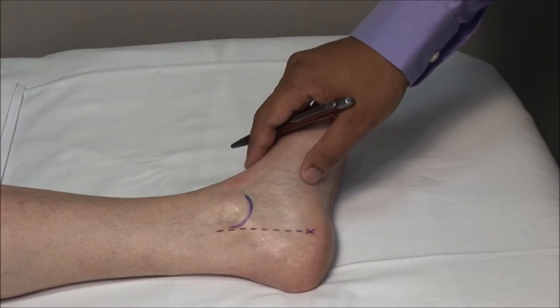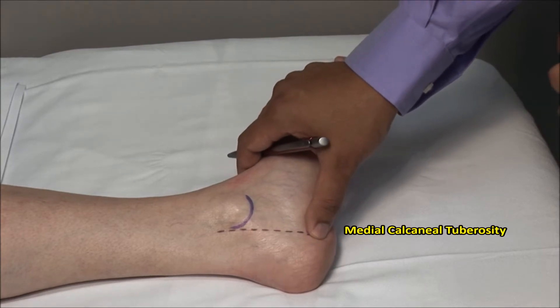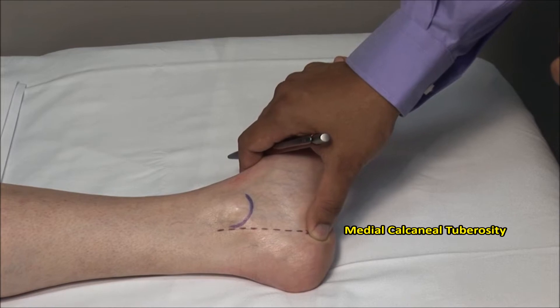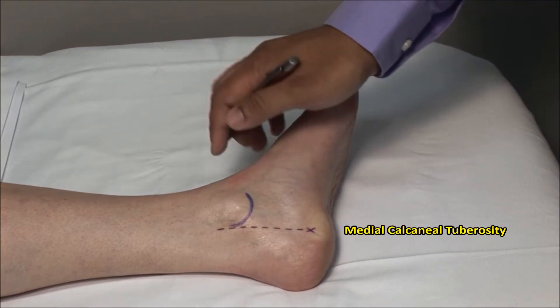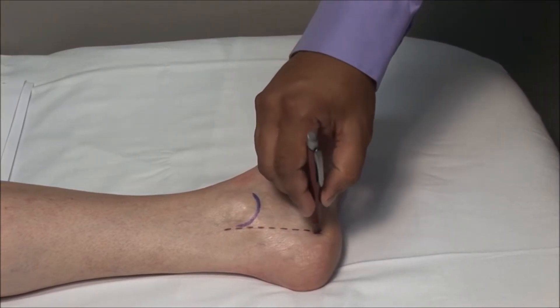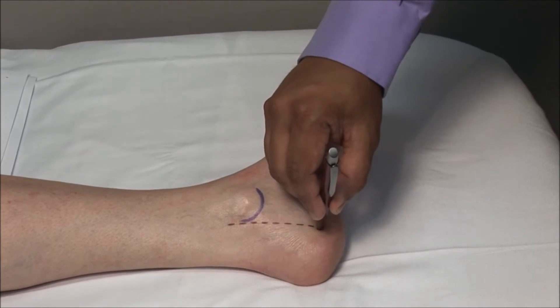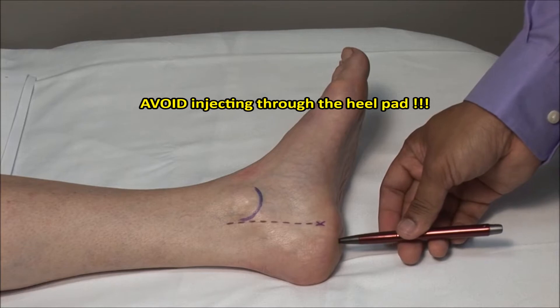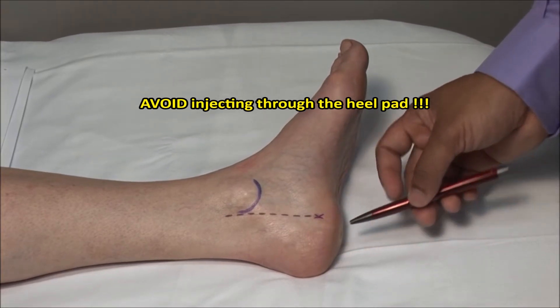The plantar fascia inserts onto the medial calcaneal tuberosity. This usually corresponds to the point of maximal tenderness. Injection is directed towards the middle of the heel using a medial approach. One should avoid going through the heel itself — this is excruciatingly painful and can also lead to heel pad atrophy.